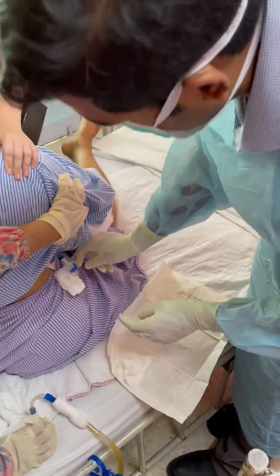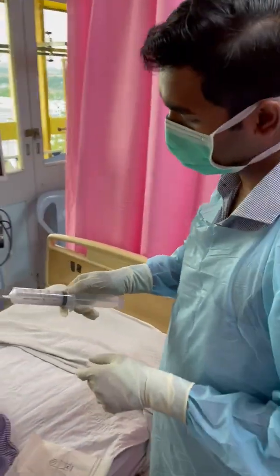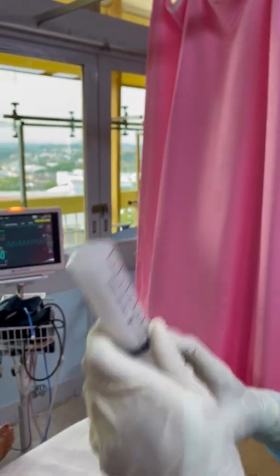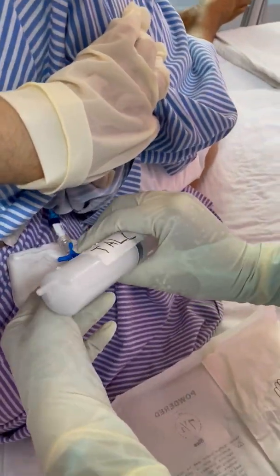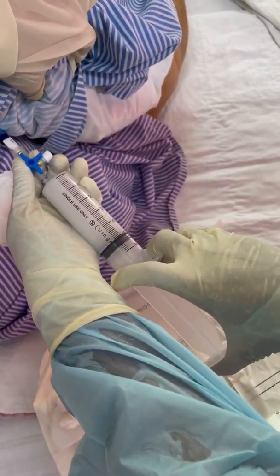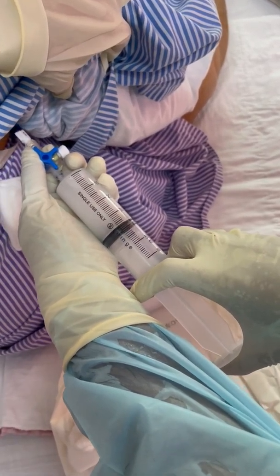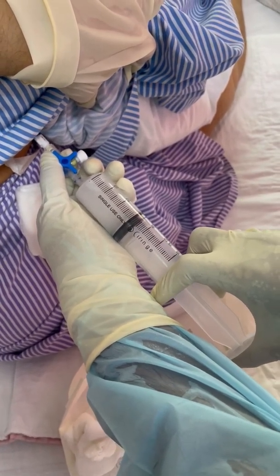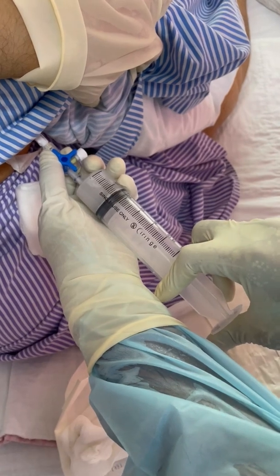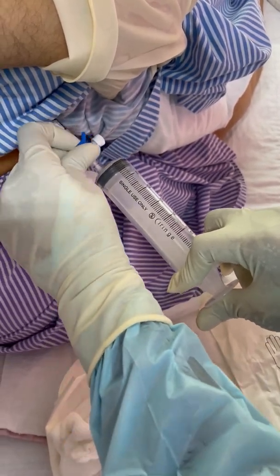Once we are confident that we have primed the patient, make sure the slurry is there. Remove the air. Open the port towards the patient and administer the talc towards the patient. Close the bung towards the patient.